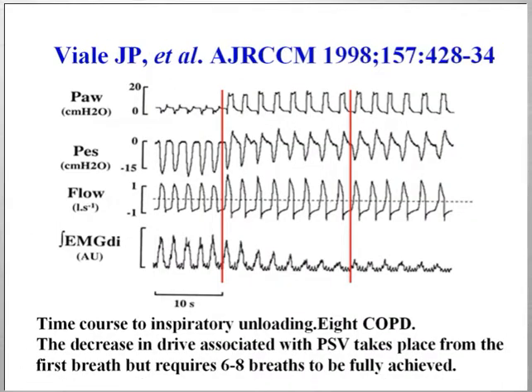And again, just to finish, this is another interesting study done a number of years ago by Jean-Paul Viale and co-workers, looking at the time course of respiratory muscle unloading during the switch from spontaneous breathing here to your left to a certain level of pressure support ventilation, here about 12 centimeters of water, in ventilator-dependent patients.